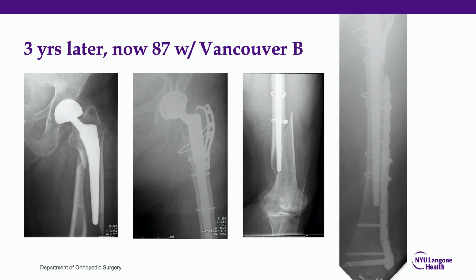And periprosthetic fractures are the gift that keeps on giving. So 3 years later, she then presents with a Vancouver C fracture distal to her revision implant. Again, I guess this is probably a B1, not really a Vancouver C, since it does wrap around the implant, although the implant is well fixed. So this ends up getting treated with an open reduction internal fixation. And obviously we need to bypass that and go long on the plate. But we can't go too long because the patient's got a trochanteric plate. But this went on to heal okay.